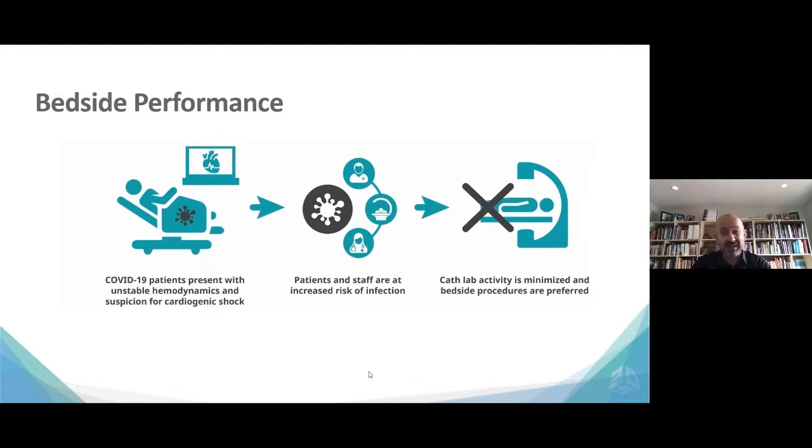It is easier to do this in the cath lab because you have help of fluoroscopy, but logistically nowadays moving COVID positive patients around the hospital is really not a good idea. You are exposing more people to the virus, you're bringing the virus into a cath lab that needs to be re-sterilized, cleaned, just presents a gigantic logistical challenge.